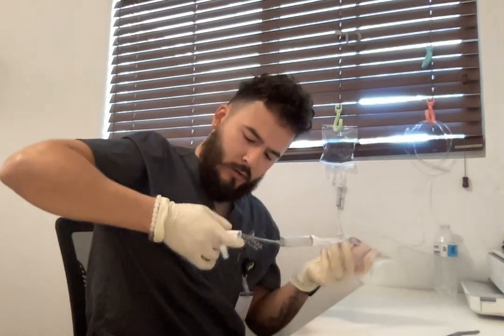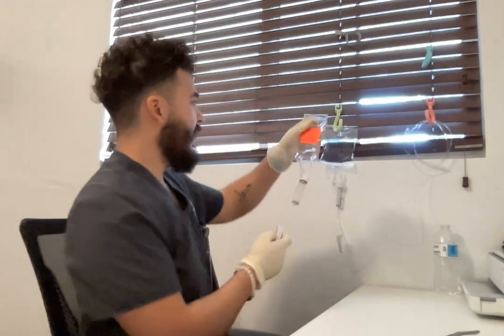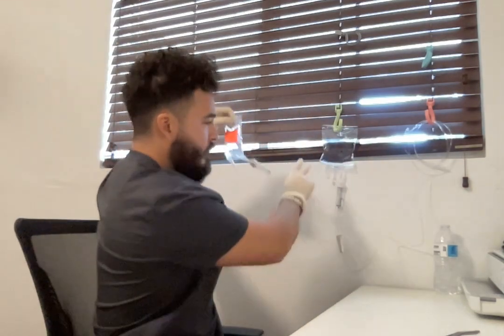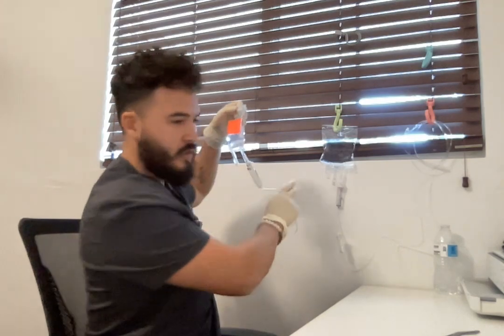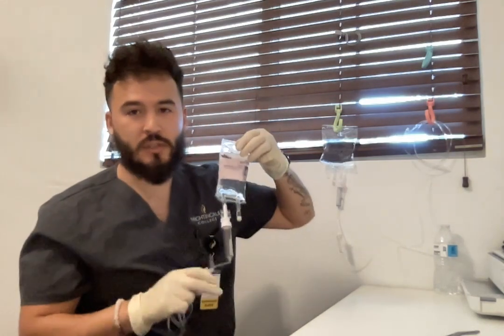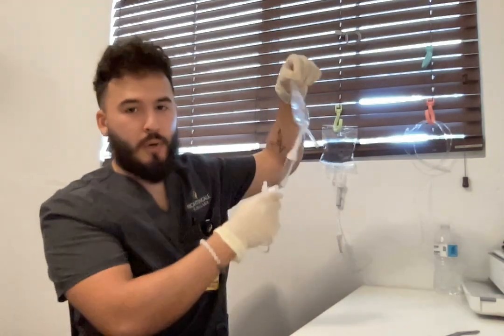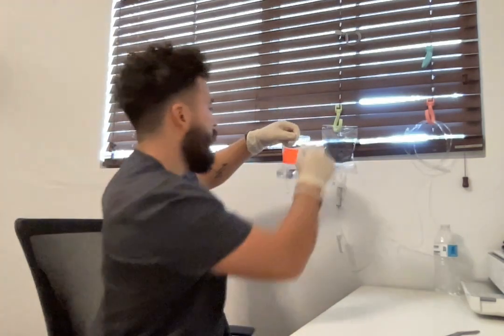Ensure that our line is fully clamped. Now I'm going to flip it and hang it. This bag I want to have 30 inches above the IV site. The fluid bag needs to be minimum 30 inches above the IV site. And then our medication bag is going to go above the fluid bag. So that's why I have it up here.